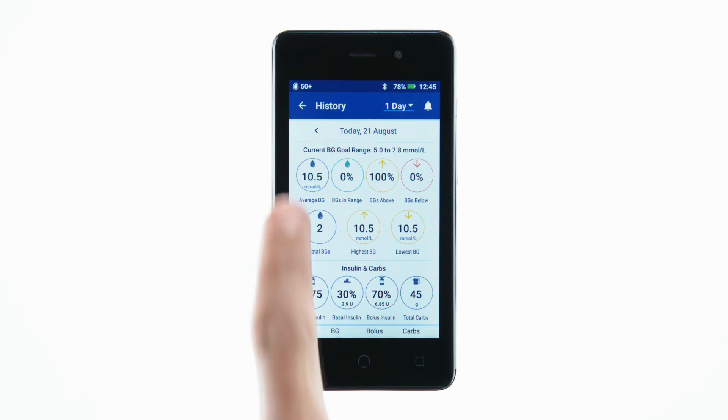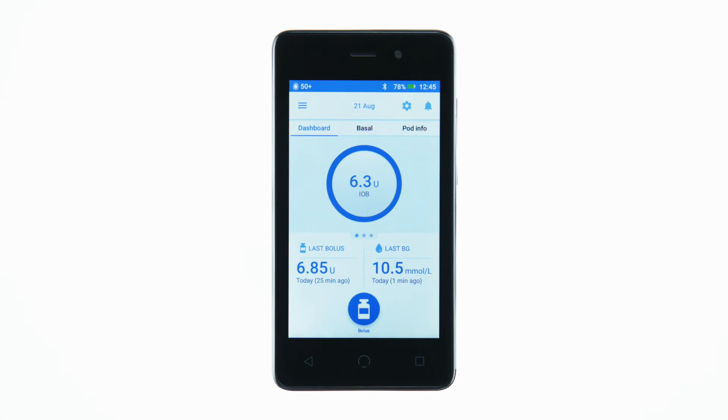Either way, your blood glucose value will reflect the date and time that you entered it into the PDM.